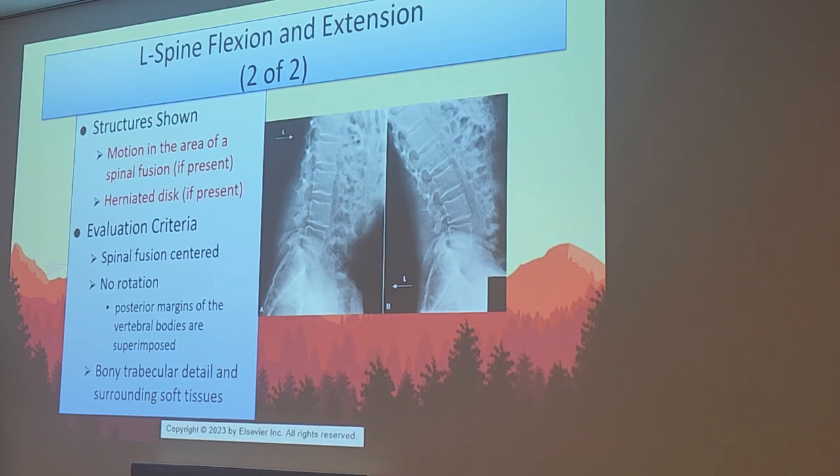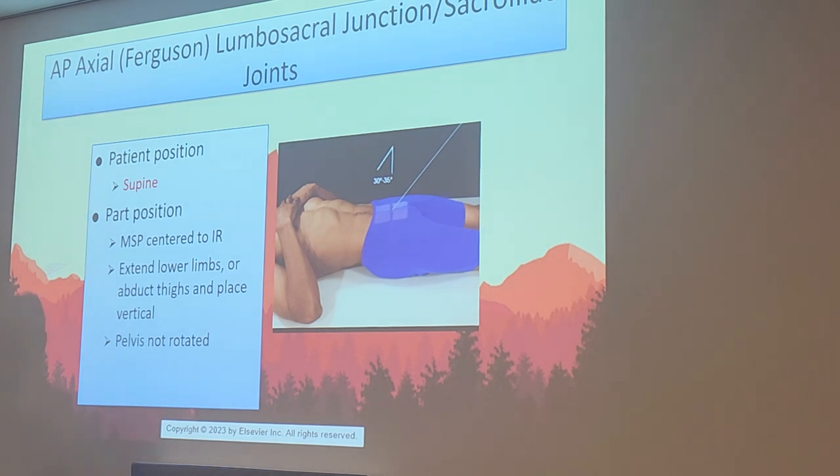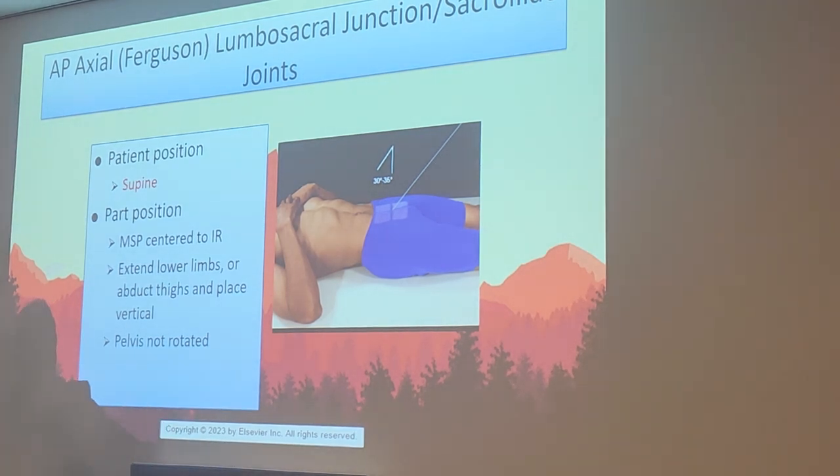You don't just hold it down. Oh, you mean intermittent pulsing. Yeah, you do that with all fluoros, or you should. Doctors should be doing that too. Oh no, the residents, they fry people. Yeah, I know, they don't care. You should always be with the little trigger one. Deep, release. Deep, release. Move. You always want to do it like that. No, they have their foot on and they're moving.